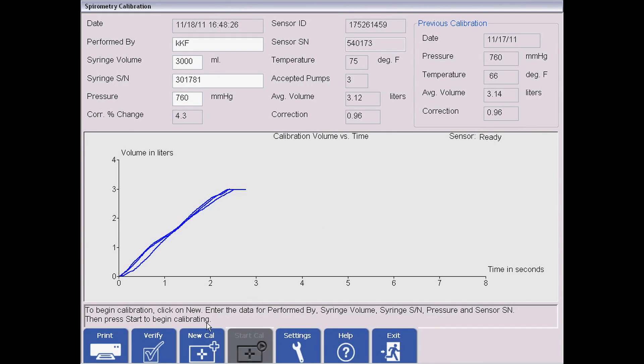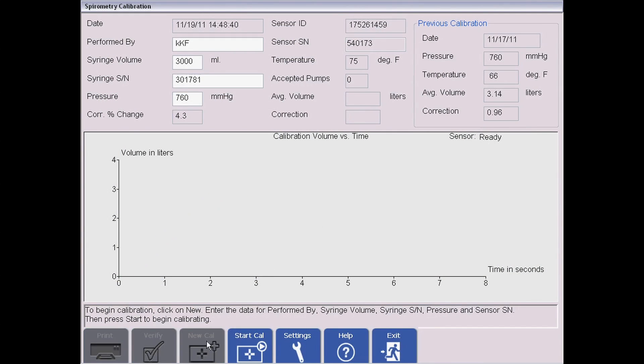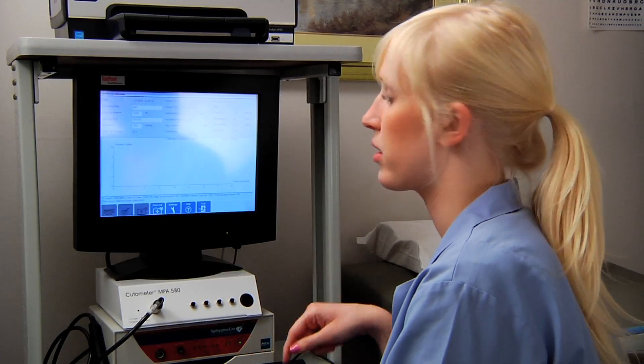All you have to do is hit New Calibration, and then when you're ready to start, hit Start Calibration. A couple of tools you're going to need — all of these come with the Midmark software and the spirometry package.